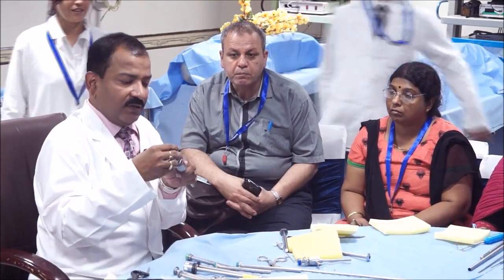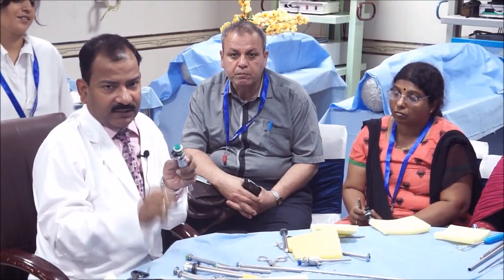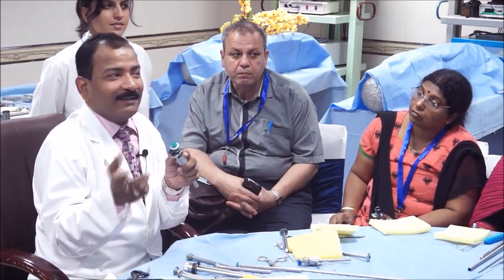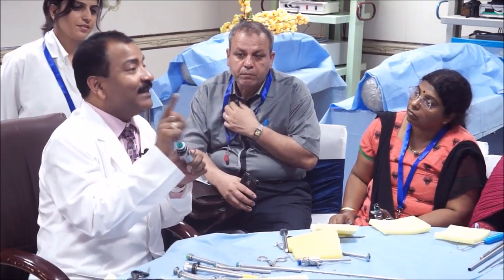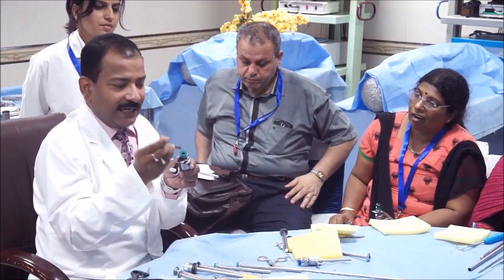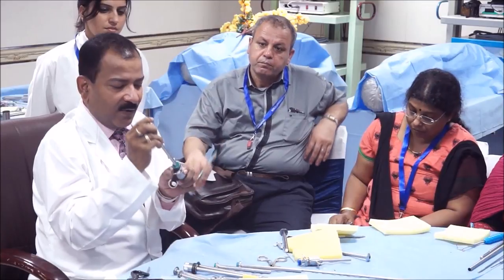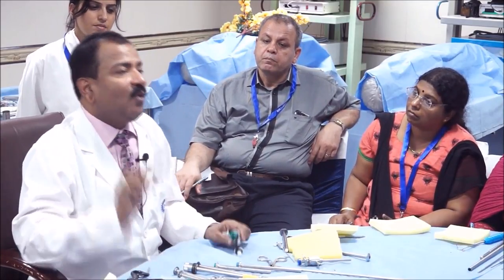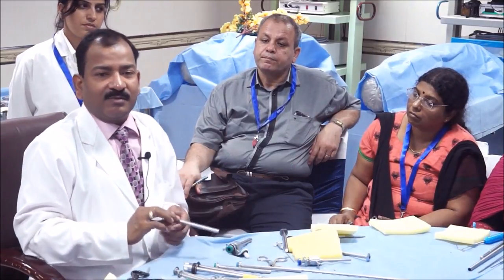Yes, that is true. And why this one? It can be easily applied. Both of you are correct. But both have their own merit and demerit also. The demerit of this one is, he is correct, the valve is open. So, it cannot be introduced alone. It has to go with the instrument and come with the instrument.